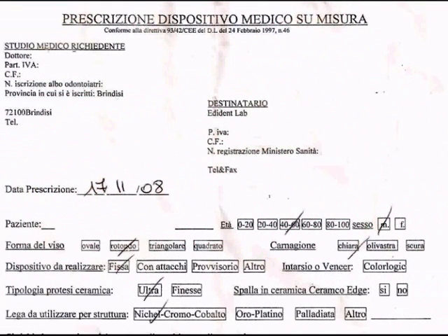When a case gets in the lab, besides getting the picture you've seen before, I also get a prescription from my doctor. Right here you can see this is a prescription — a medical custom-made device. With this prescription, I have the patient's name, but you don't see it here because of privacy. I can see the age of the patient — this patient is between 40 and 60 years old. I can see the sex; it's a male in this case. I can see the shape of the face — it's a round-faced person — and the color of the skin, which is very light.